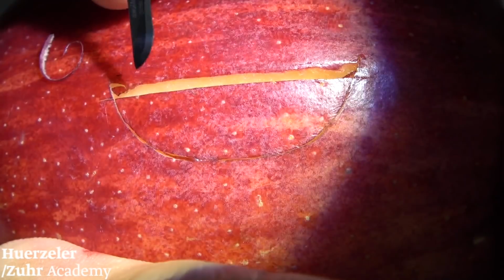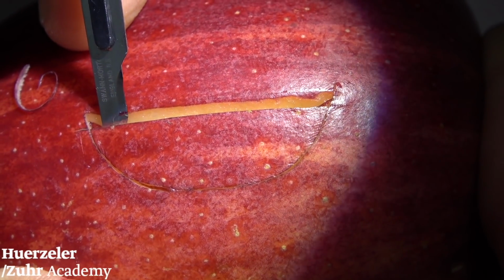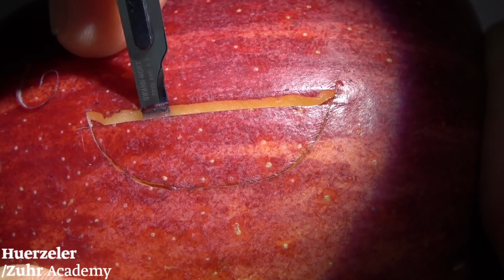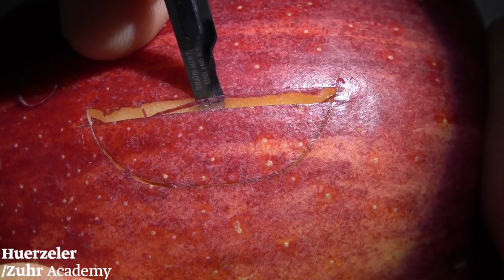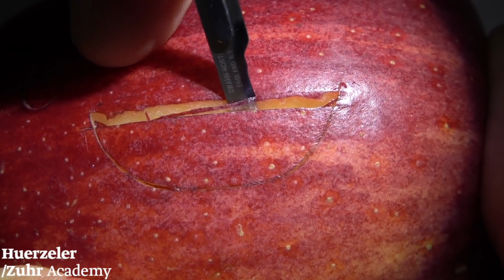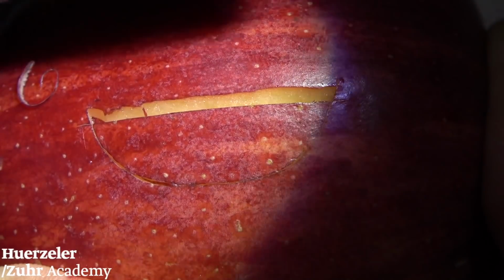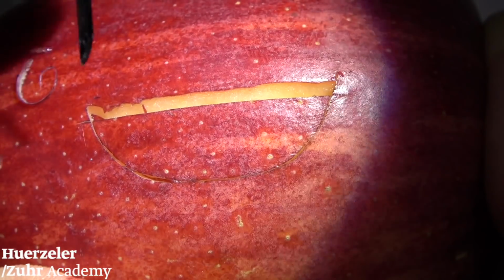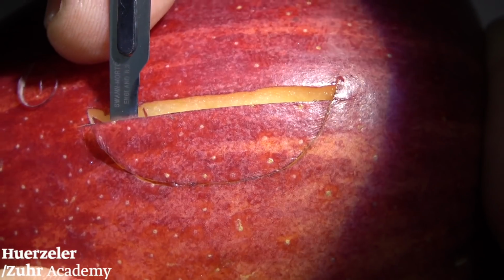Okay? And now, even more, I go step by step, trying to create the perfect coronal flap design. Push the tissue out. I go a little bit deeper. Doesn't matter when you cut off a little bit of tissue coronally. This is not a problem. Now more. You see how the flap comes out?